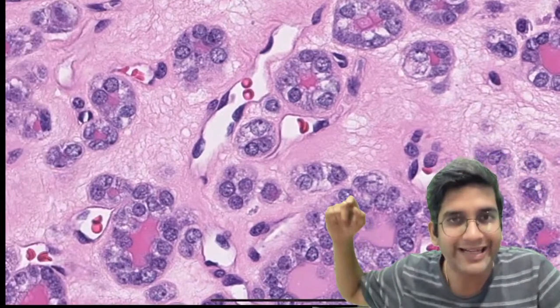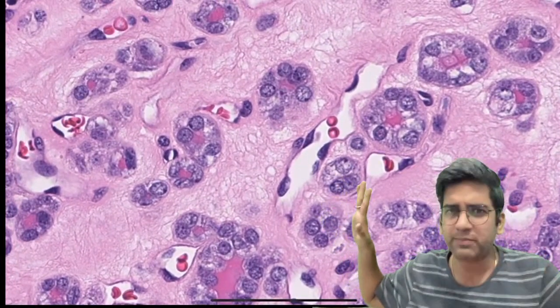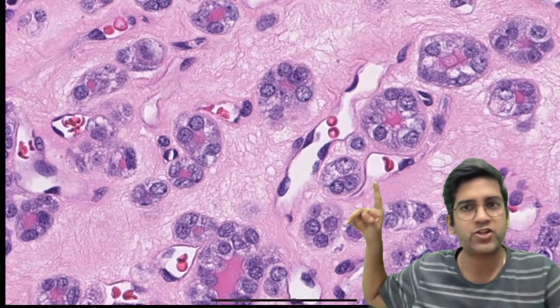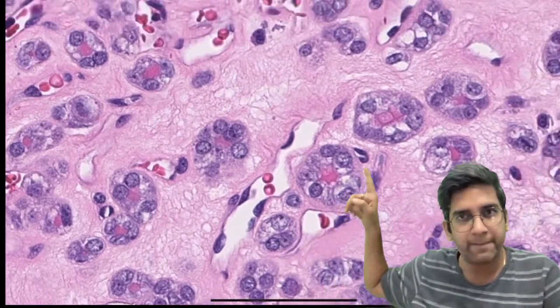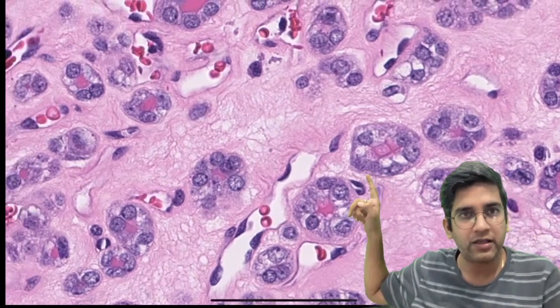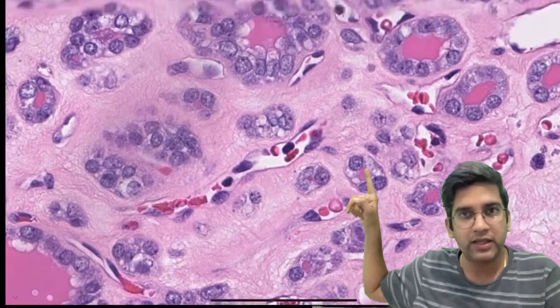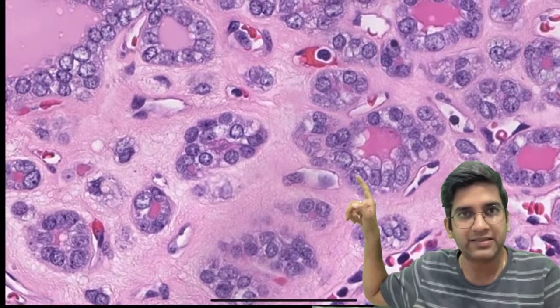Now, let's go a little bit here. Though not a clear Orphan Annie, is there nuclear clearing? It's not a perfect Orphan Annie, but I'll definitely accept it, it's not like a classic PTC. I have a clearing here. There's a nucleus that's completely clear, right? Look at this nuclei, I have a little bit of clearing here. It has clearing by default.